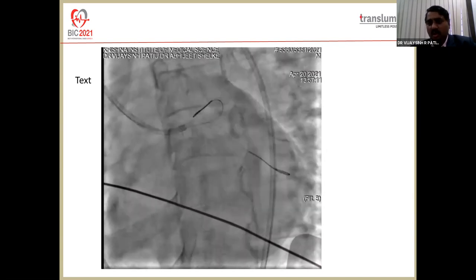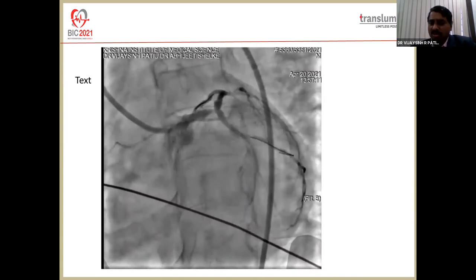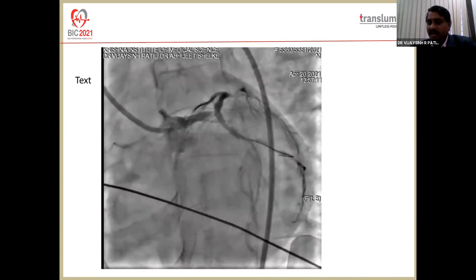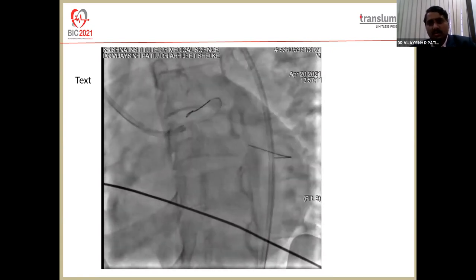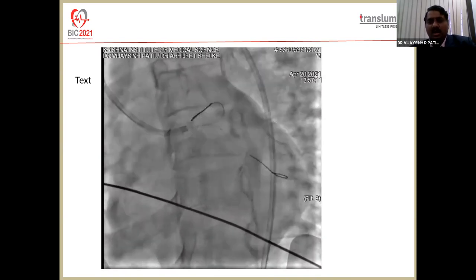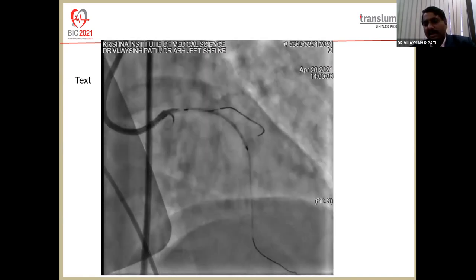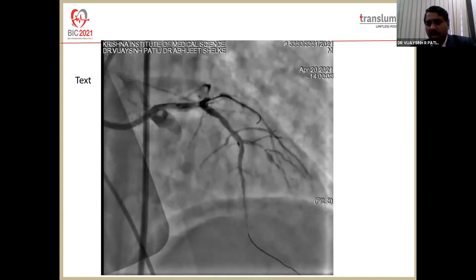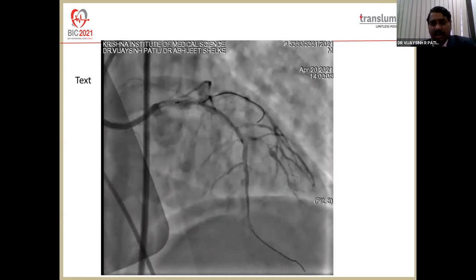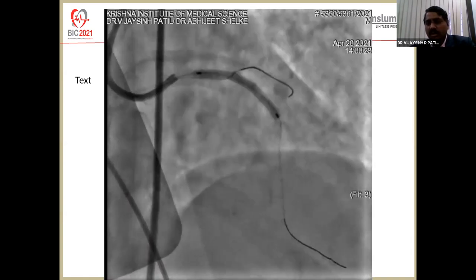So we decided, since it was clearly a severely symptomatic patient with cardiogenic shock, severe metabolic acidosis, almost about to go on a ventilator, and the patient was still conscious, that we would do a left main stent with a crossover from LM to LAD. And we would see subsequently later on if we faced any problem. So this was the first decision, and we took a 3.5 by 36 millimeter everolimus eluting stent, and it was placed from almost mid shaft of left main to the LAD, covering the proximal LAD lesion completely. And it was deployed at around 14 atmospheres.